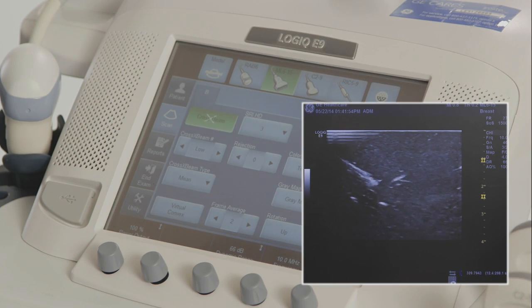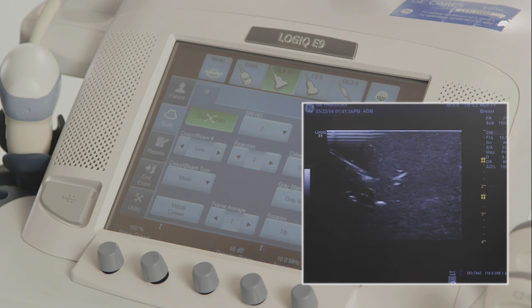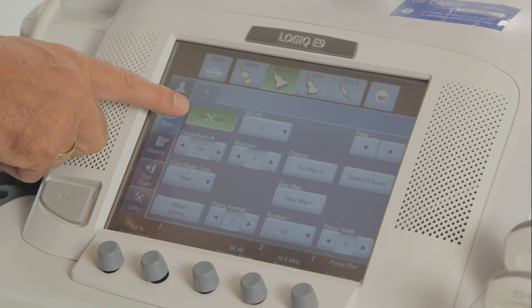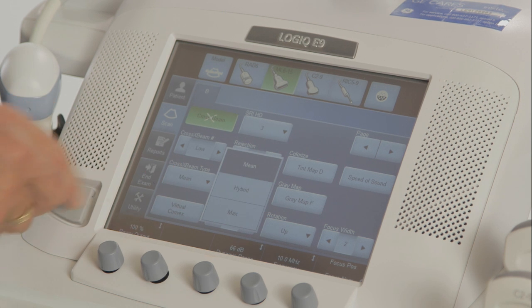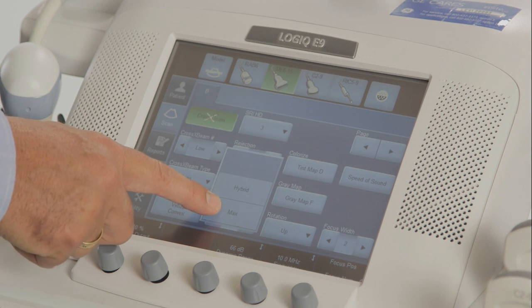If you need to have crossbeam active to visualize the lesion, you can change the crossbeam type from mean to max, which will give you priority to the maximum reflectors or the needle.